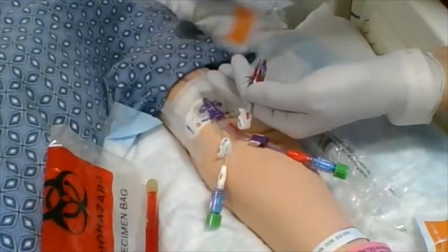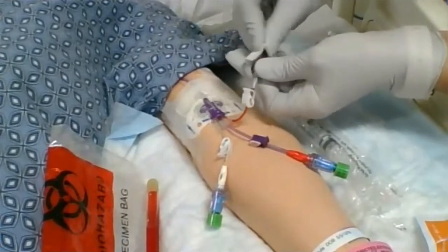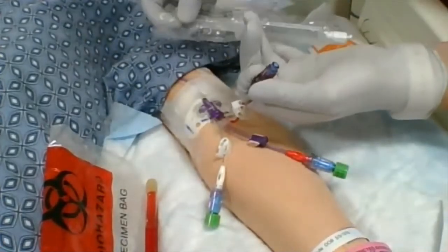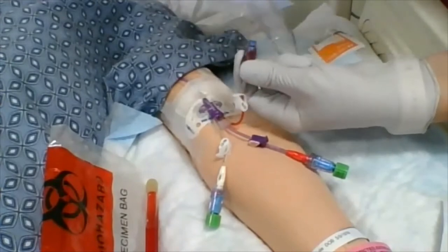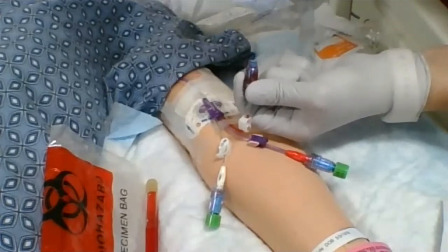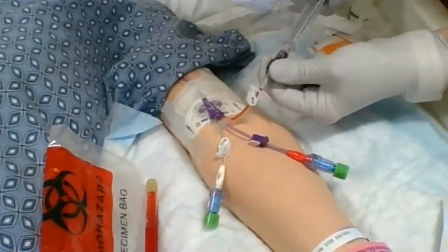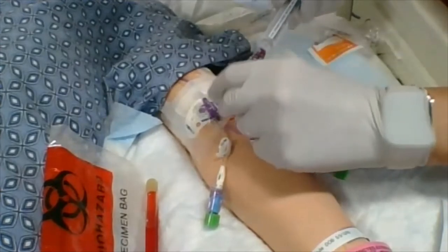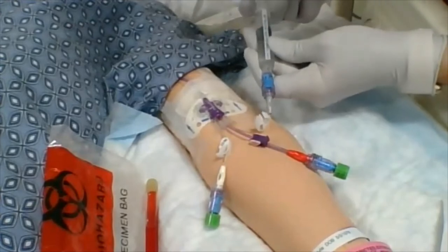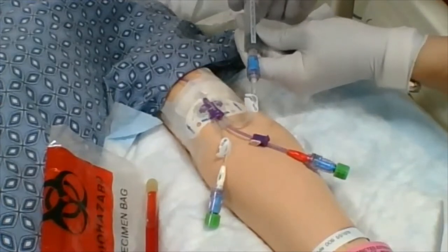Clean the clave — 15 seconds. Nice new saline. Notice how I protect that clave and hold it away from being dangled on the bed or in contact with anything else. I open up my syringe without touching it everywhere, connect, undo the clamp, and give it a good flush. You can use that little pulsating flush technique — nothing too rough, and there's no resistance, so this feels great.